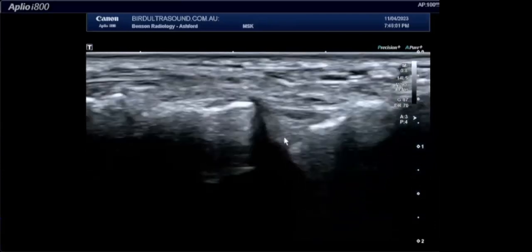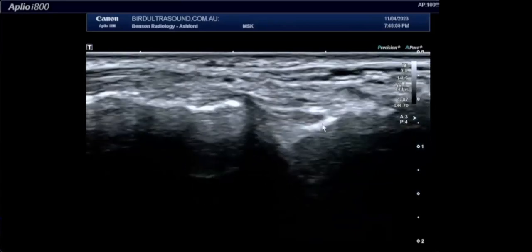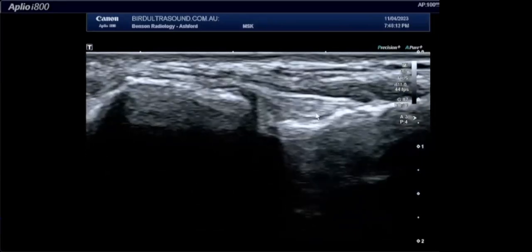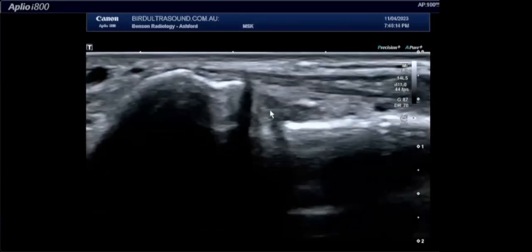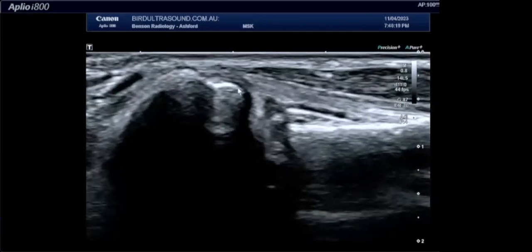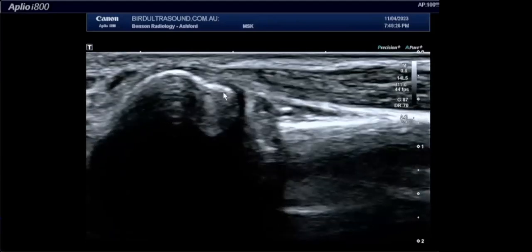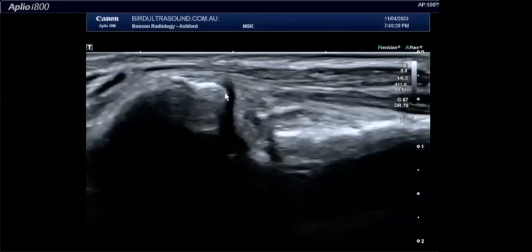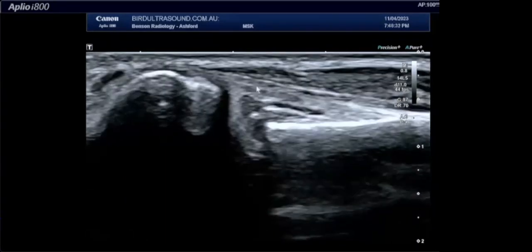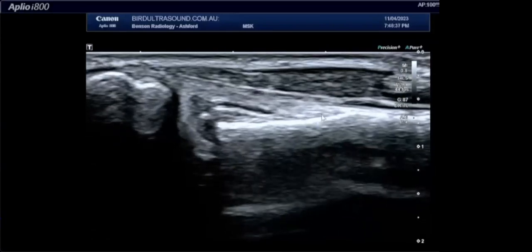And there's a series of these small ligaments that really make up the joint capsule between the calcaneum and the cuboid. The most common one that I see injured is not so much these small minor ones, although these may be involved, but the most dramatic thing that I see most commonly is where this anterior tubercle of the calcaneum is fractured off with an avulsion fracture as part of an injury that involves the release of energy through the Chopart line, and you'll see a fracture in this location. The distal end of the calcaneocuboid ligament right down here is rarely involved. This is a fairly benign area here.